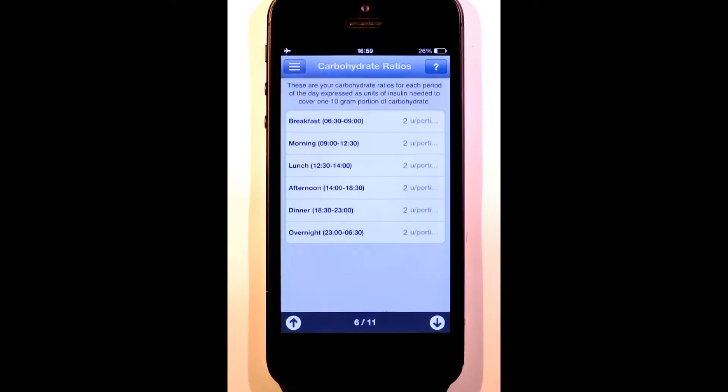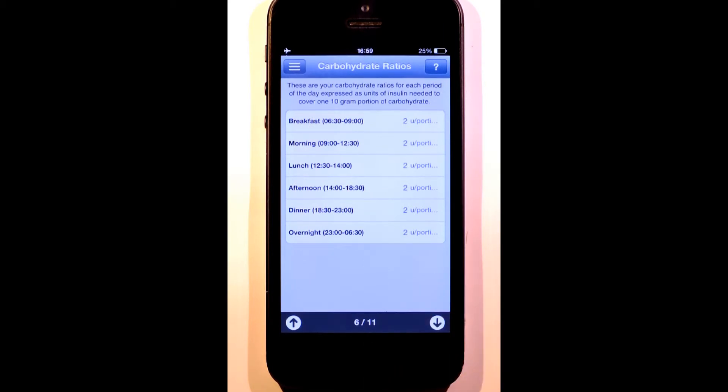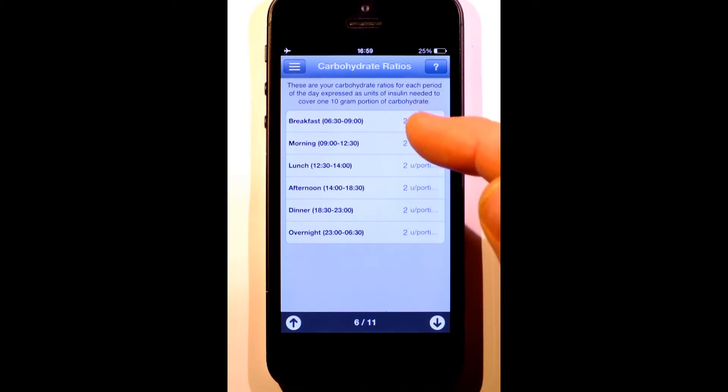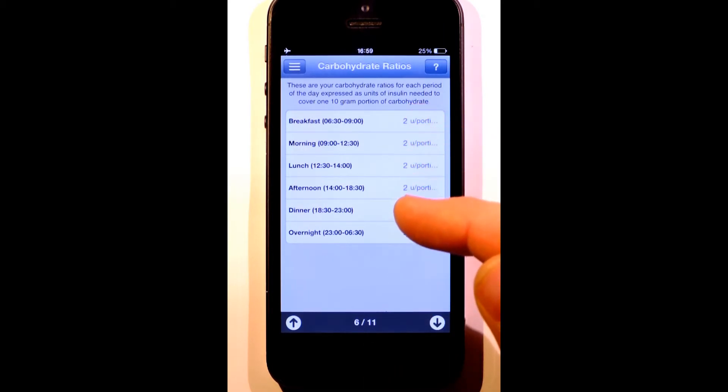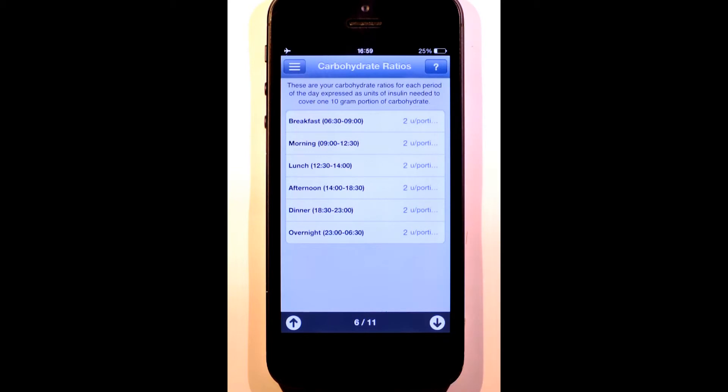The carbohydrate ratios determine how much insulin you need to cover a given amount of carbohydrate. In my case, I'm using 10g portions and my ratio is 2 units of insulin for each 10g portion. We'll now move away from the time band related settings.